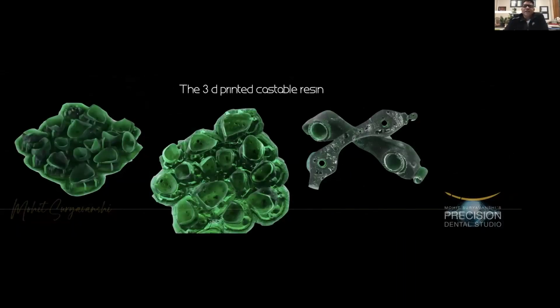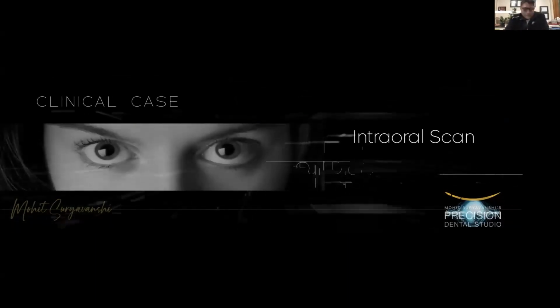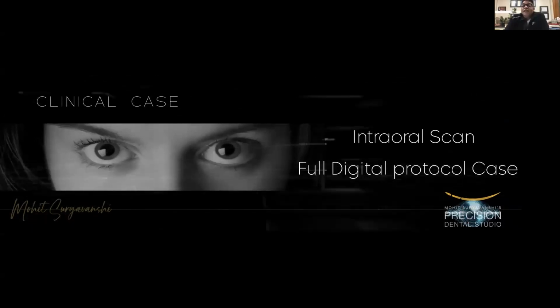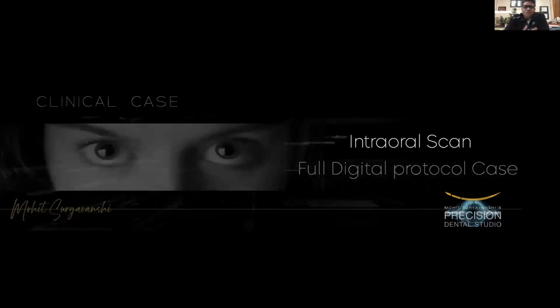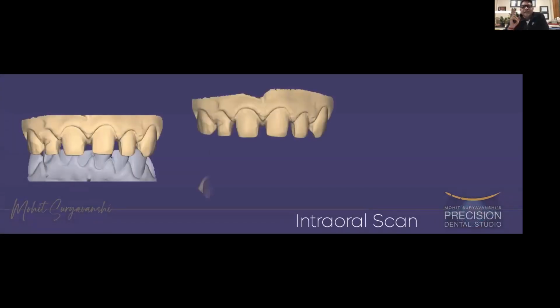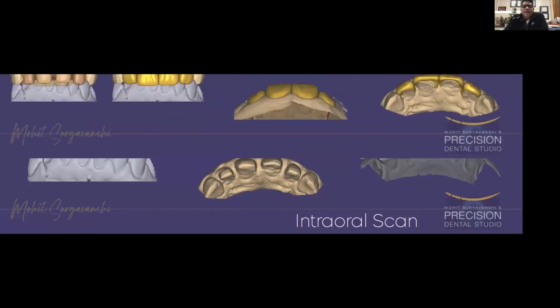So we have these 3D printed castable resins, and we also have this milled wax, which we have to replicate now. So there comes the digital era where now we receive the intraoral scan. This is how an intraoral scan is received from a distant dentist almost 2000 kilometers away from me. Life is easy now. There is no need to post the case. And we start designing it.